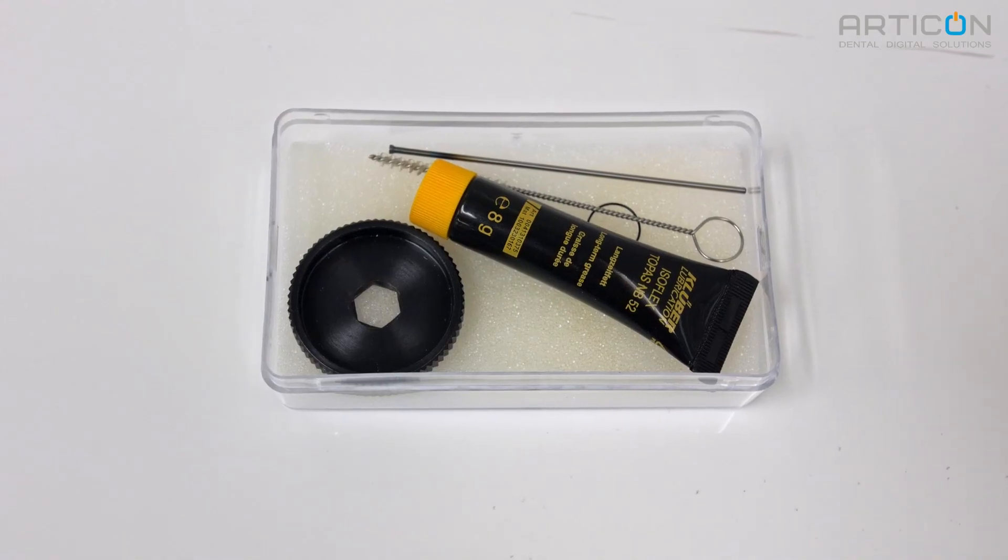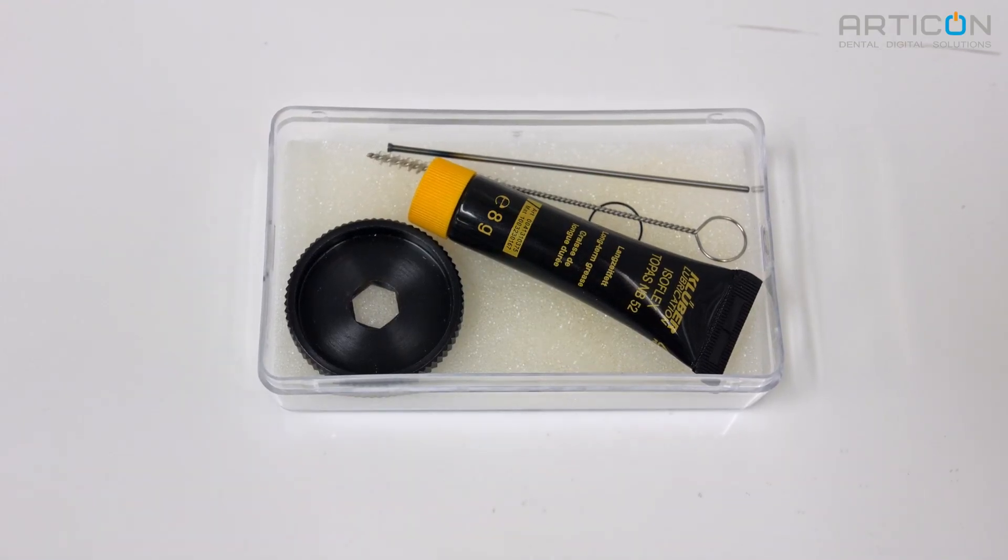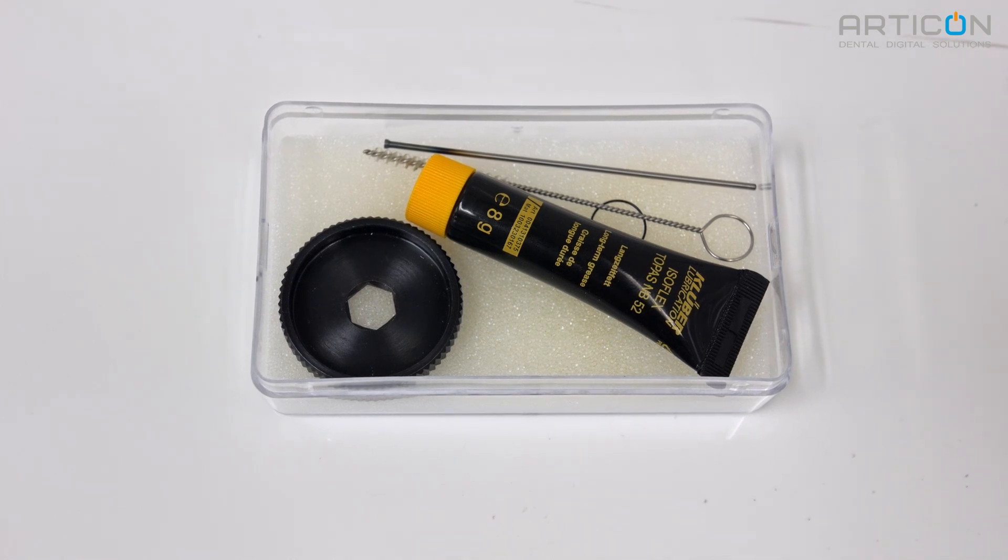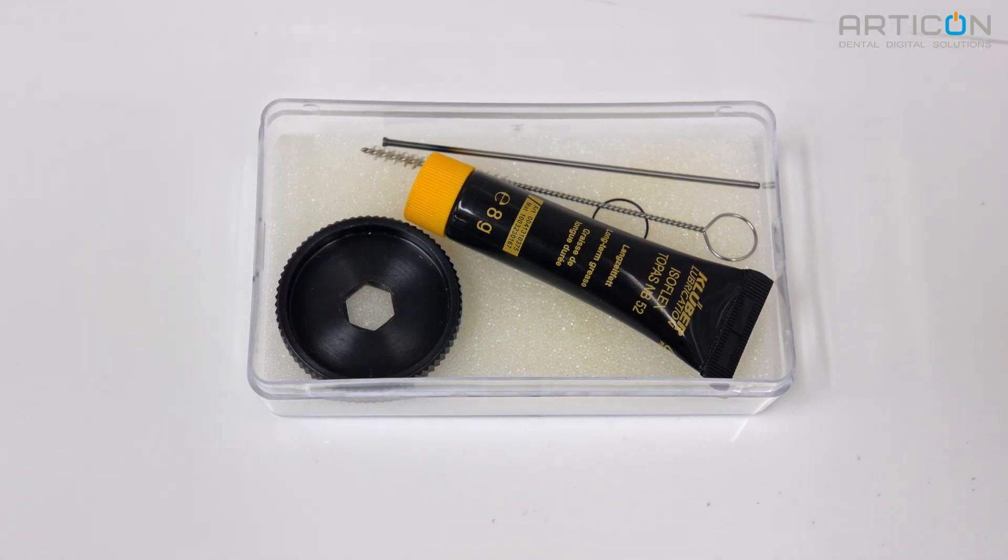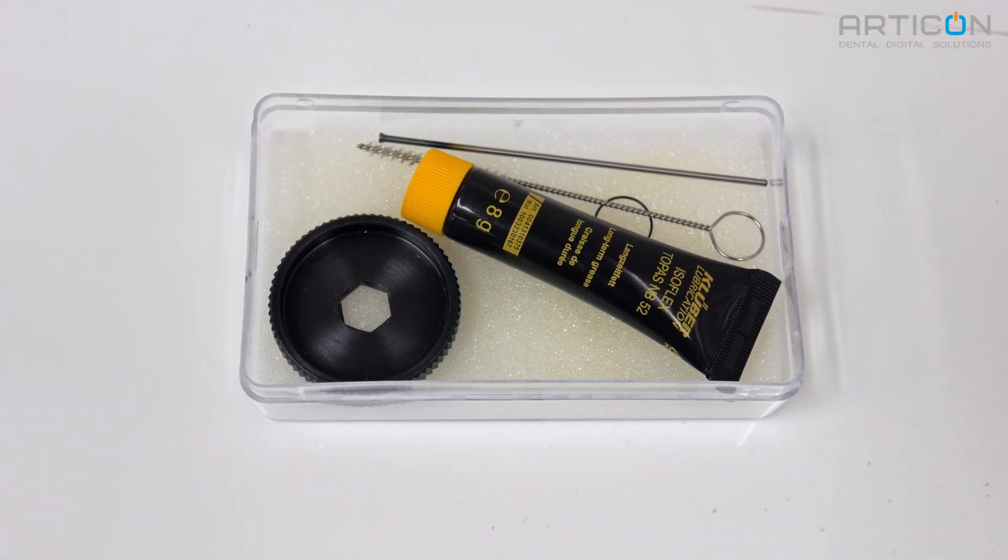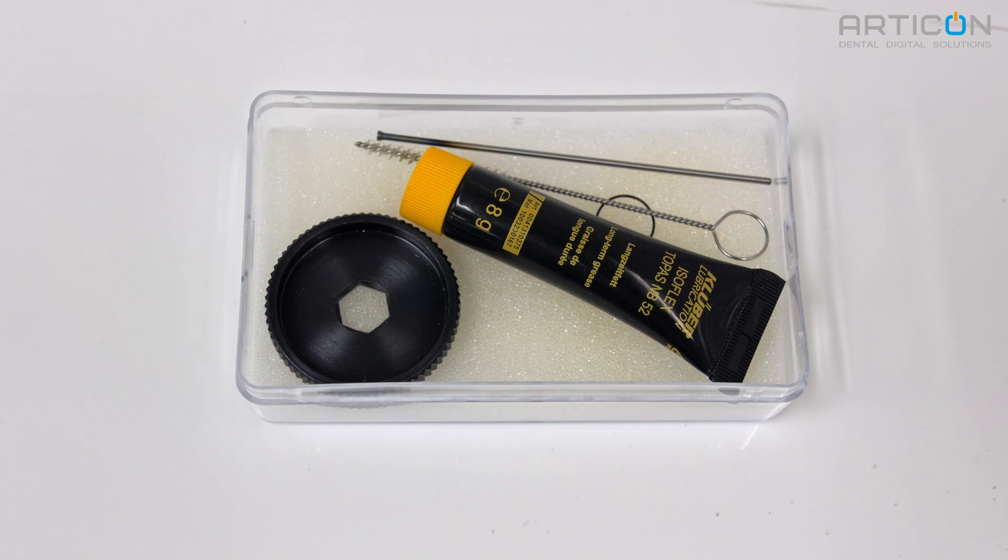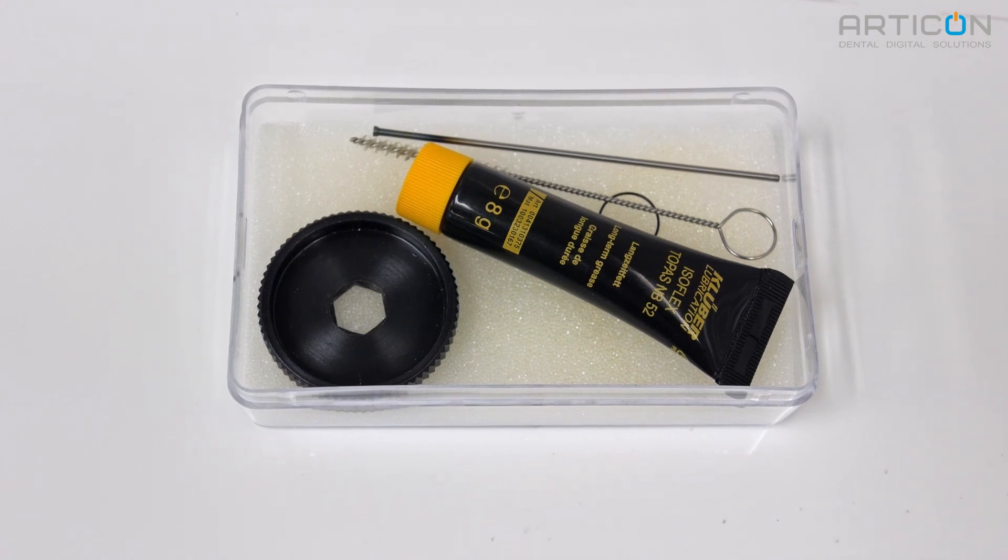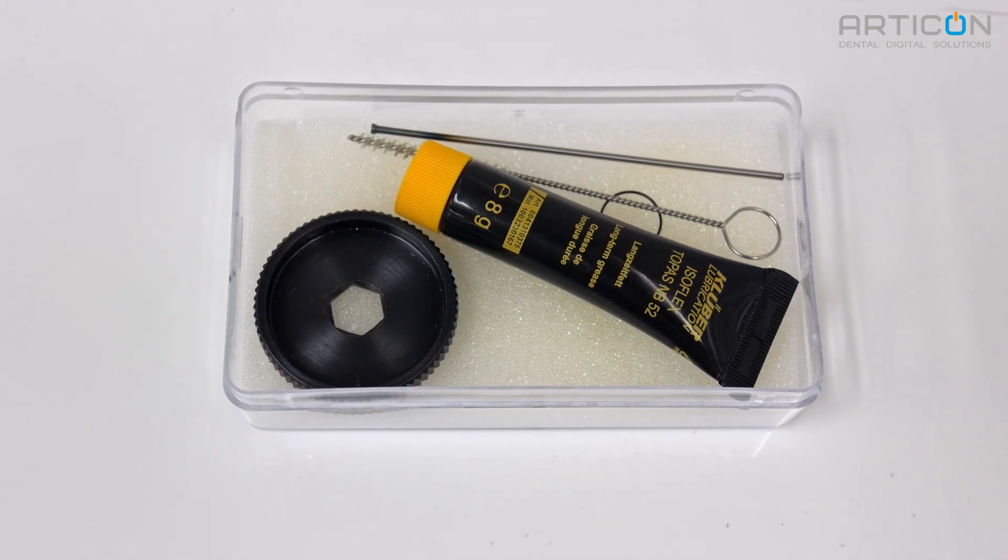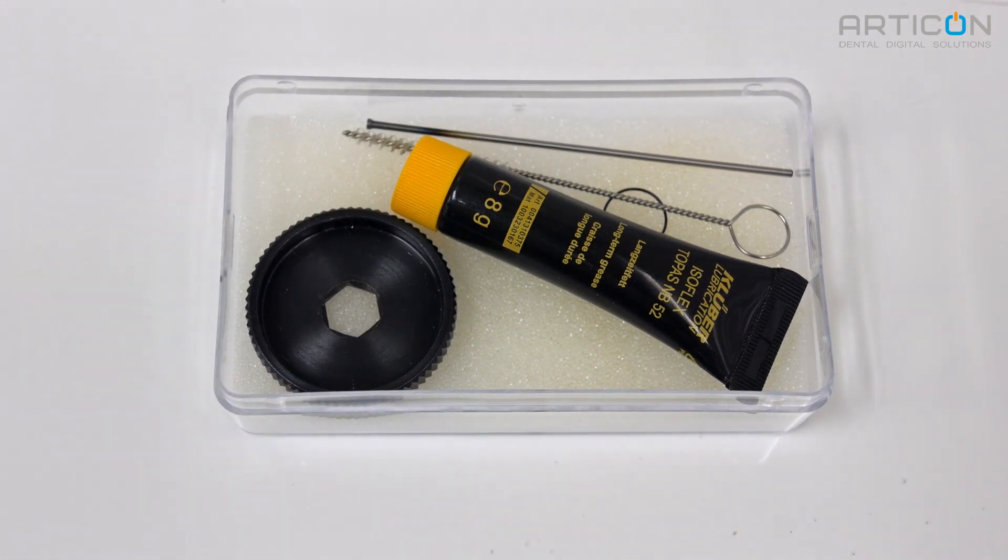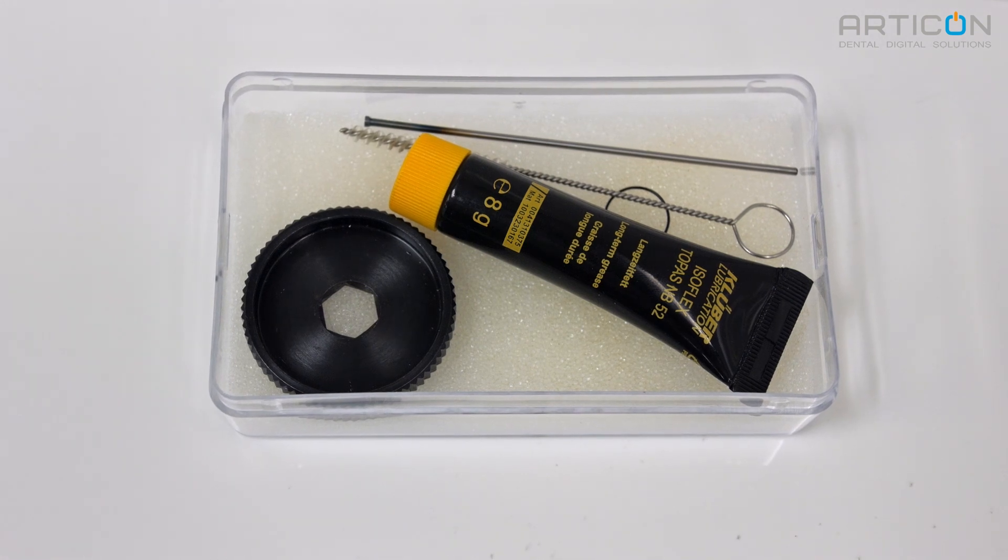You will need the collet maintenance kit, which was supplied with the milling machine. We are going to use collet removal tool, cleaning brush, felt cone, and lubricant. If you need to purchase a new maintenance kit, please contact Articon. You can find contact information in this video description.